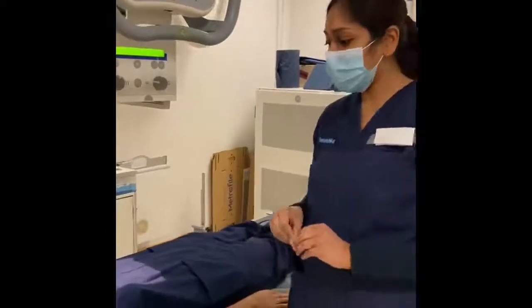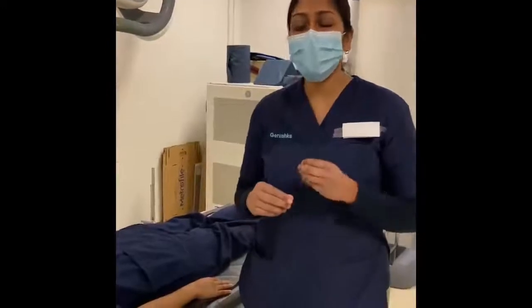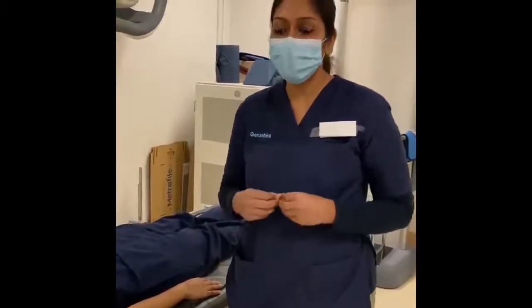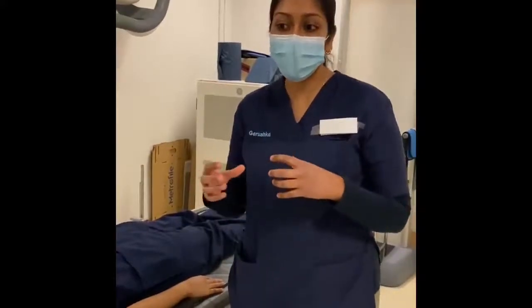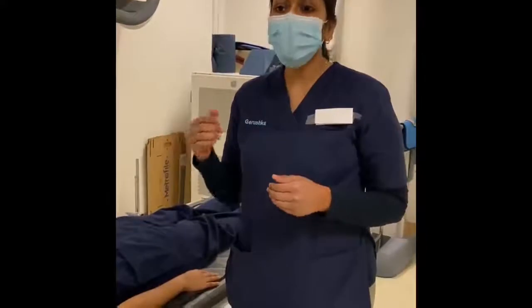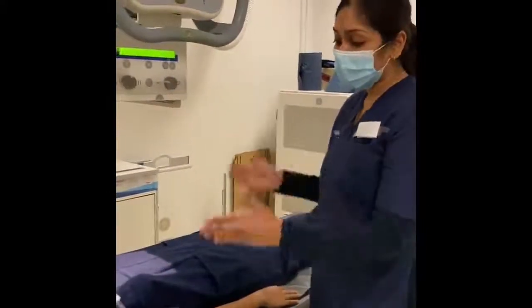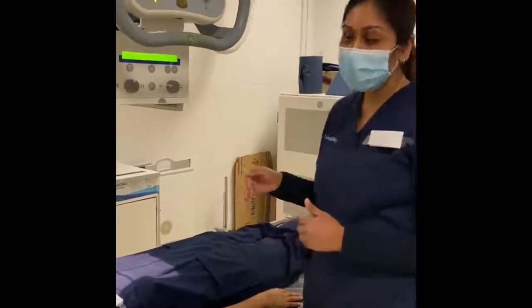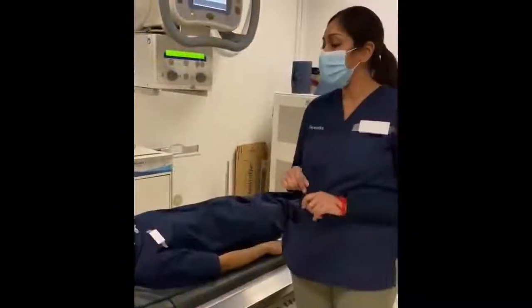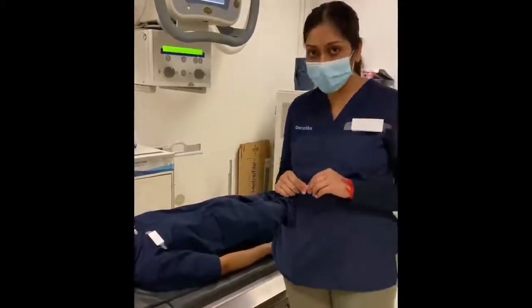So now we're just going to move on. Take note that when you're writing your exams, you need to mention whether it's done erect or supine, as that will also determine your centering ray. Because this patient is lying supine, the centering ray is in a vertical direction. Our first view that we're going to do is the T-spine AP view.